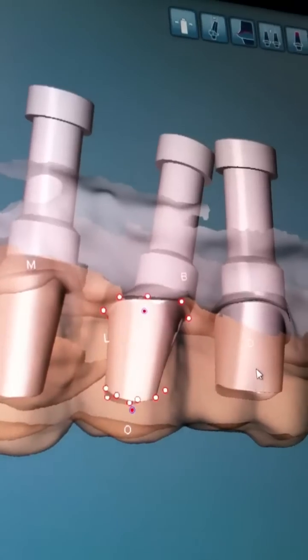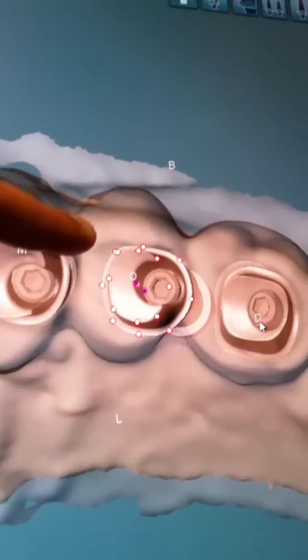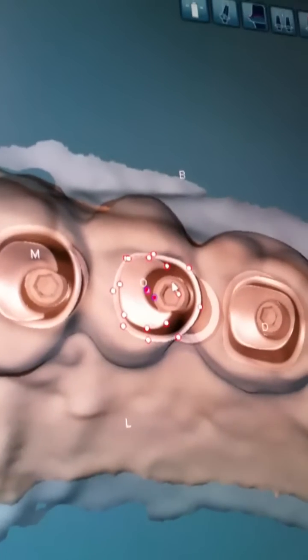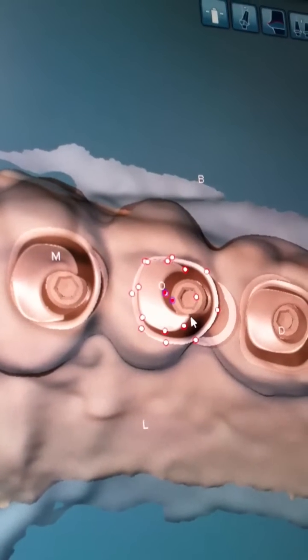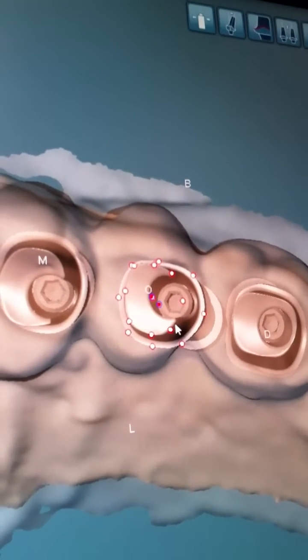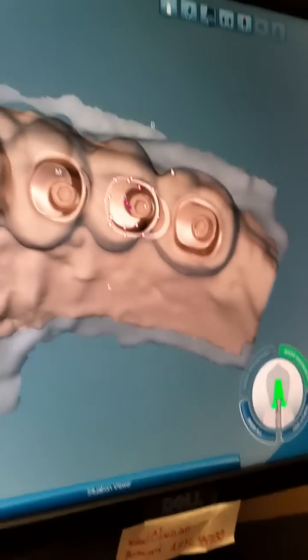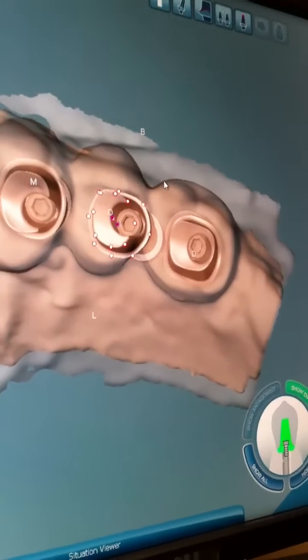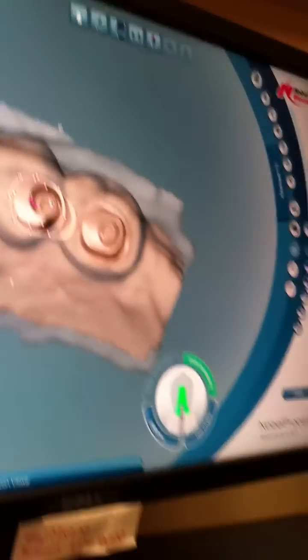Can we see an occlusal view of that? Sure. So my occlusal hole, my access hole, is to the distal regardless, even though we have an angle like that. Well, if you're doing this cement retained, you won't have an access hole. If you're going to do the screw retained, it would be in your interproximal. You would have a problem with a thin shard of ceramics that would fracture off. You actually would have your screw coming out of your interproximal. You wouldn't have a contact on that tooth if you did it screw retained.